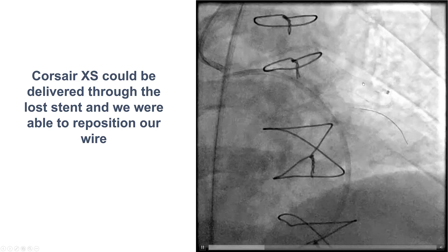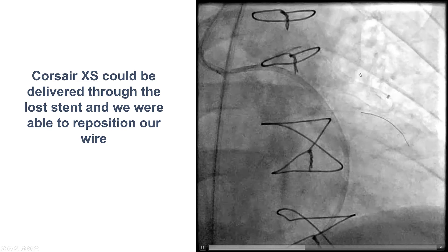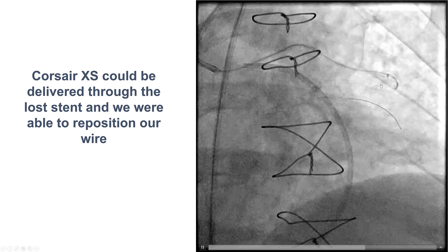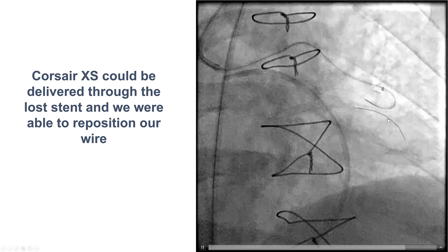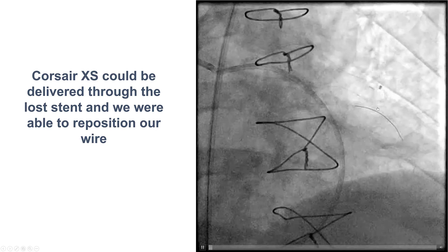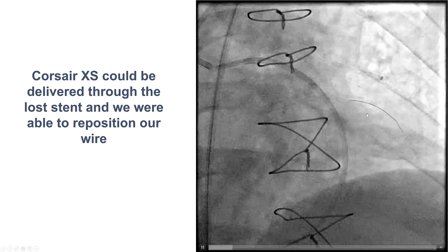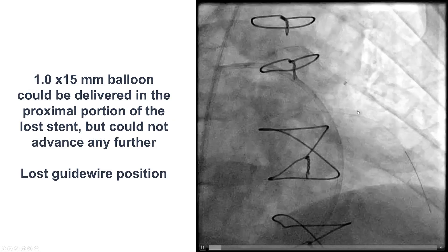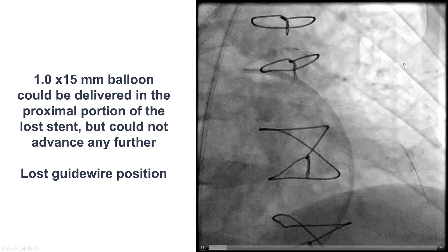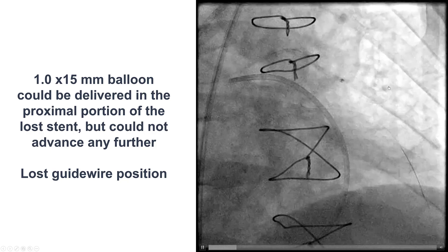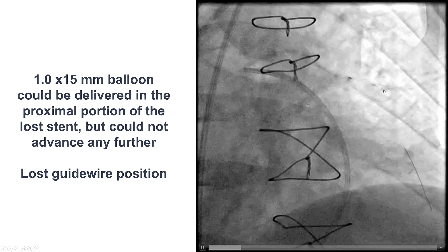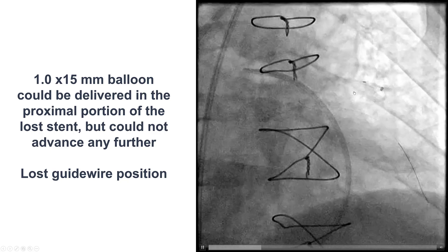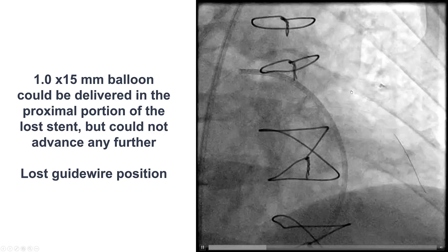After multiple further attempts, we were able to advance a Corsair XS microcatheter. We had loss of wire during the attempts to deliver balloons through the lost stent. We were able to get the 1.0 mm balloon a little further down, but not all the way through. In the process, we lost both guide and guide wire position.